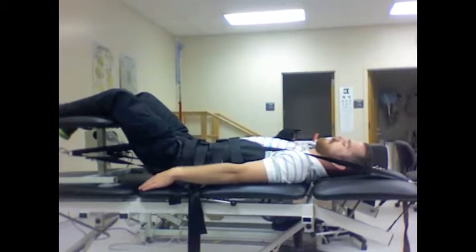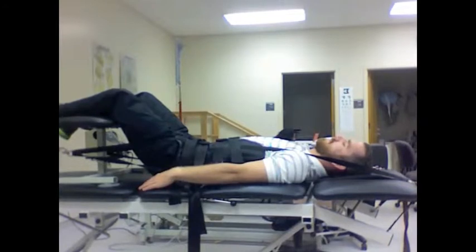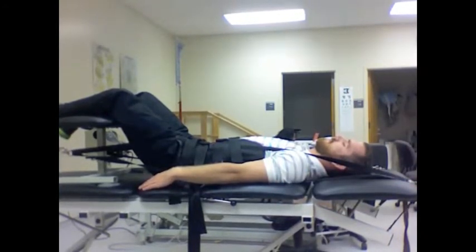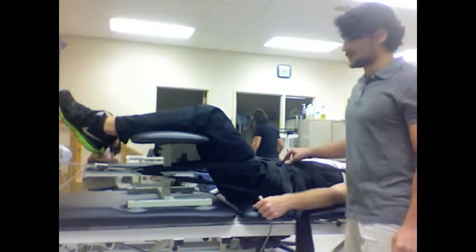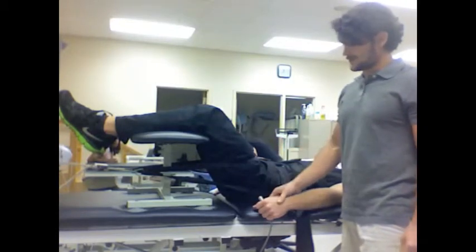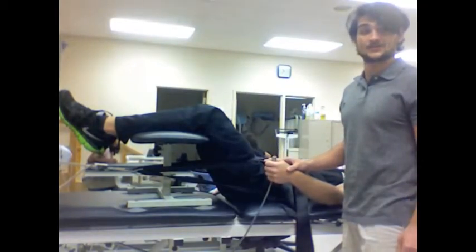The patient has been placed in a supine position with his feet resting comfortably on the traction stool, and we've made sure that the sliding aspect of the traction table has been unlocked. Right before we begin treatment, we're going to double check one more time and make sure that the patient's thoracic and lumbar straps are nice and secure, and we're going to give the patient an emergency off switch in case he feels any kind of discomfort or pain during the treatment.